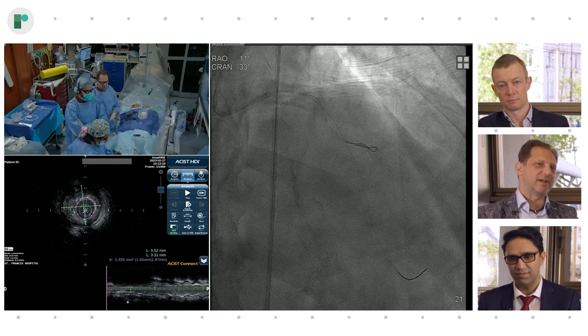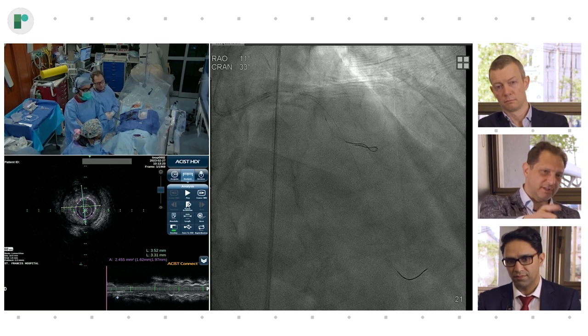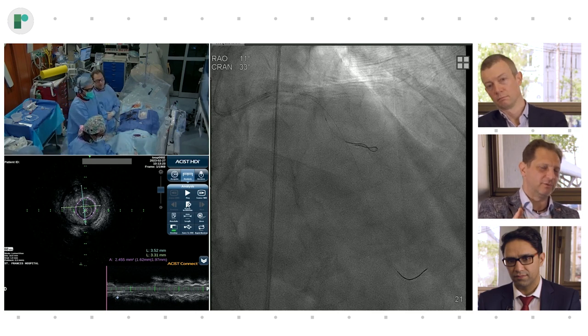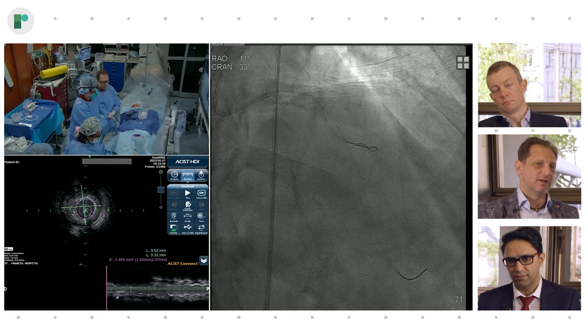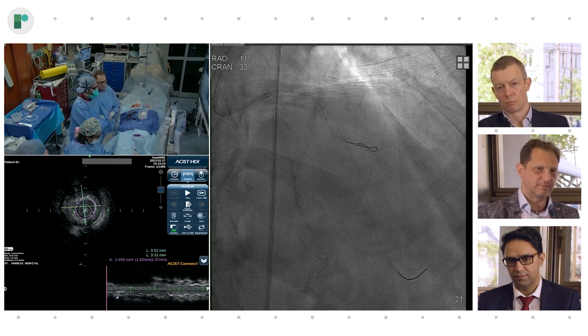And so let's talk about the sizing. If we have less than 50% plaque burden, meaning a reasonably good landing zone, we want to maximize the diameter of the stent, so we go by an EEL strategy. The EEL strategy is you measure the EEL like we do in this case, right? And you downsize to the next available stent size. In a case like this, where there's a lot of diffuse disease without a good landing zone, a safer strategy might be to go by lumen and then upsize to the next available stent.